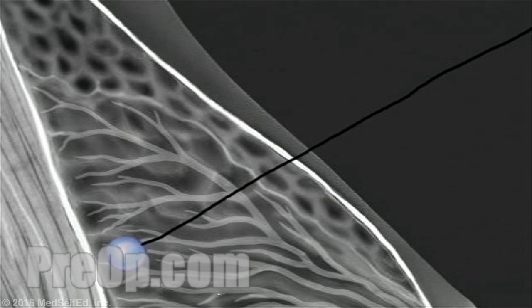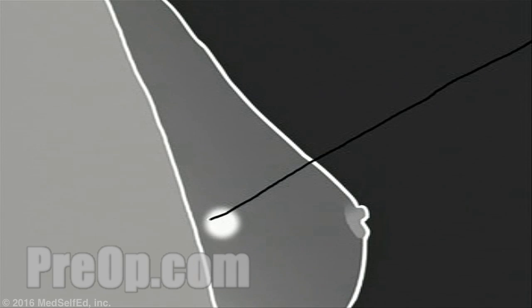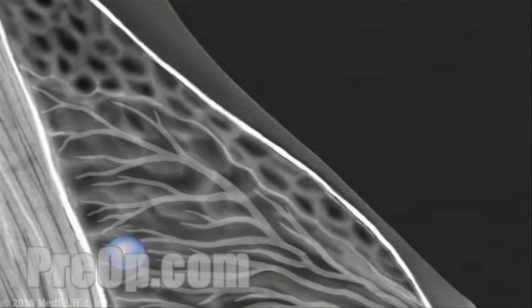This wire will serve as a pointer for the surgeon during your operation. The radiologist will perform another mammogram in order to verify that the wire has been placed correctly. It is possible that the wire will have to be moved or repositioned and a mammogram taken once again.